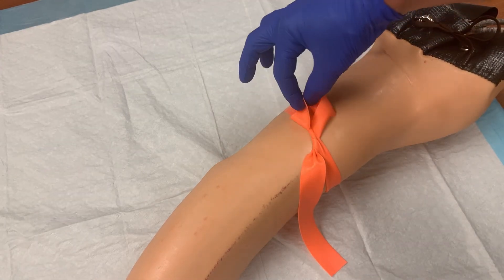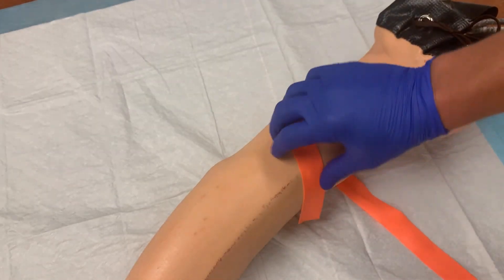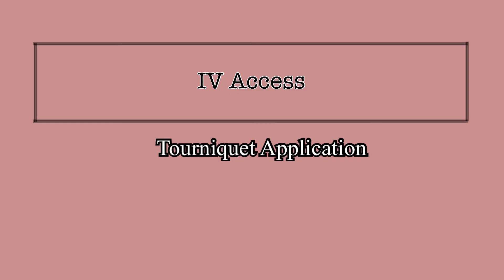If tied correctly, the tourniquet is easily removed. Just pull on the tail end that created the slipknot loop, and the knot will release, effectively popping the tourniquet off. Take the time to get the tourniquet on correctly. Being able to locate the best veins is a huge step in setting yourself up for a successful IV placement, and the best way to do that is to use a tourniquet.